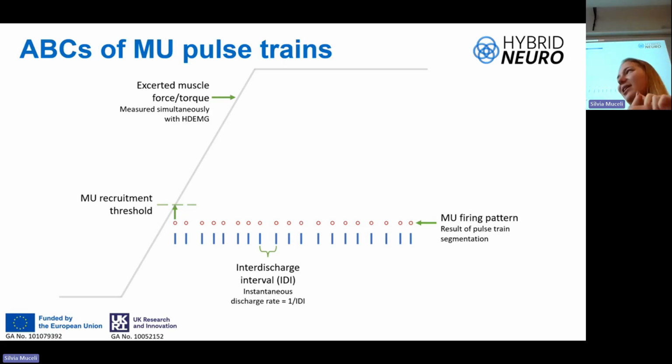We were also researching the rate of agreement, normalized root mean square disagreement, the editing time, number of used actions, and so on. And the level of expertise was never a significant factor, except when we inspected the first firing. So finding the true first firing is a challenge, and it can be difficult, and you need to have a lot of knowledge and a lot of experience.